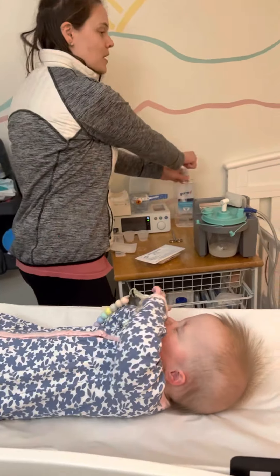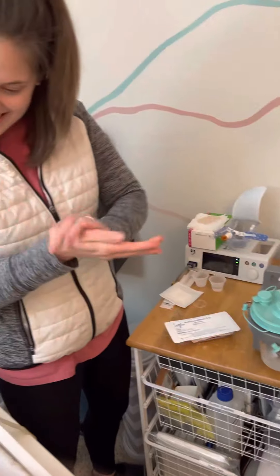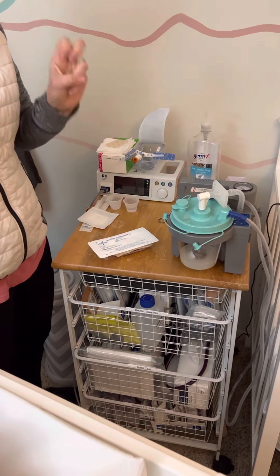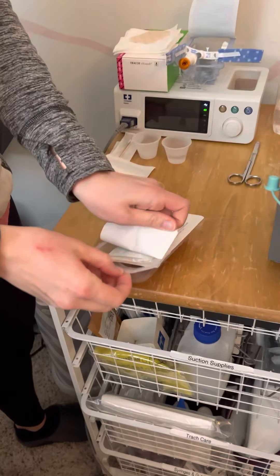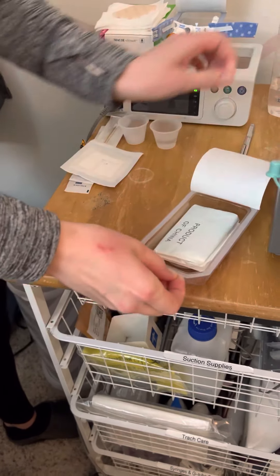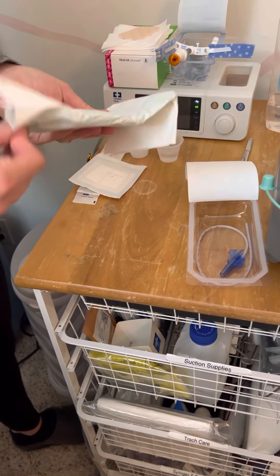To get started, sanitize your hands 100% of the time so you start with clean hands. In the hospital this is a sterile procedure; in the home setting it's just considered clean. Then you open your catheter — you want to find a flat surface to work on, as that's going to be easiest.